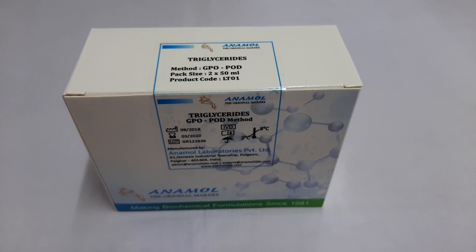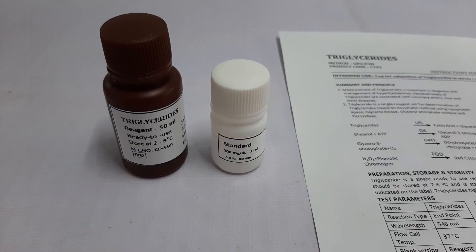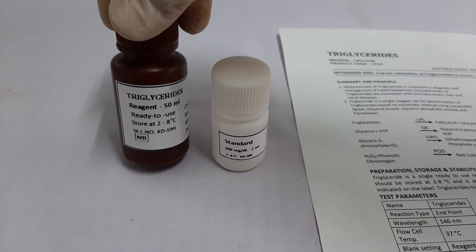Hello everyone. In this video tutorial, we will see how to run a triglyceride test using the kit manufactured by Anamol Laboratories Pvt Ltd. First, let's have a look at the kit components.